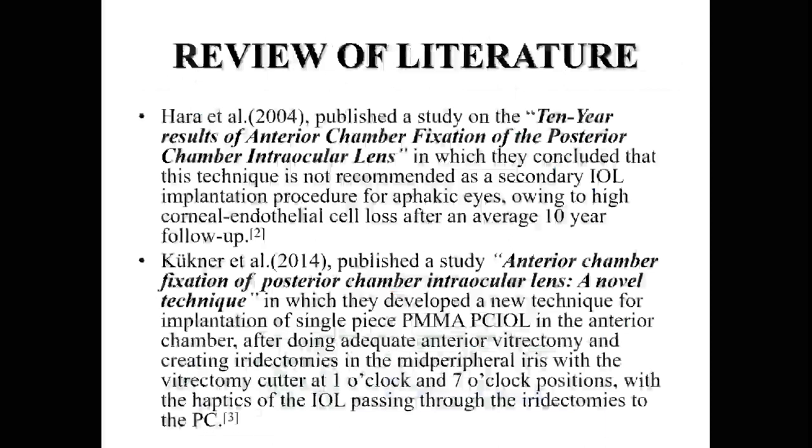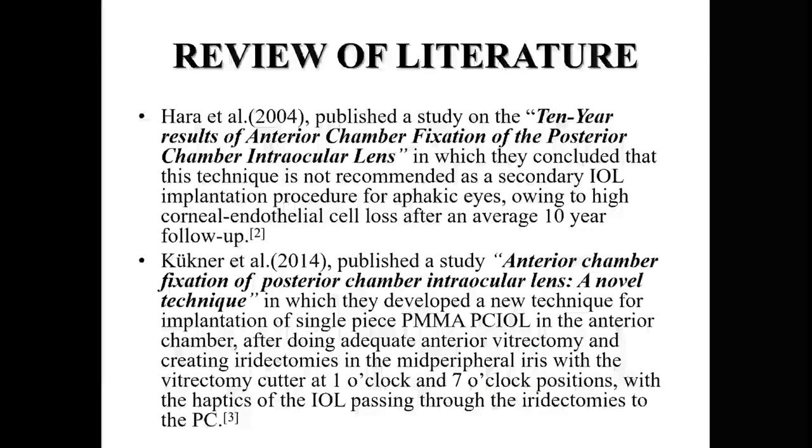So this is the review of literature wherein Hara et al. in 2004 had published a study on the 10-year results of anterior chamber fixation of posterior chamber intraocular lenses, in which they concluded that this technique is not recommended as a secondary IOL implantation procedure for aphakic eyes owing to high corneal endothelial cell loss after an average 10-year follow-up. Kuchner et al. in 2014 published a study, anterior chamber fixation of posterior chamber intraocular lenses, a novel technique in which they developed a new technique for implantation of single-piece PMMA PC IOLs in the anterior chamber after doing adequate anterior vitrectomy and creating iridectomies in the mid-peripheral iris with the vitrectomy cutter at 1 o'clock and 7 o'clock positions, with the haptics of the IOL passing through the iridectomies to the PC.